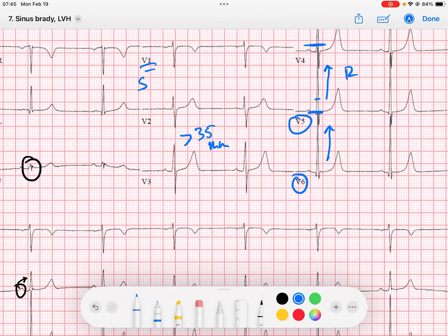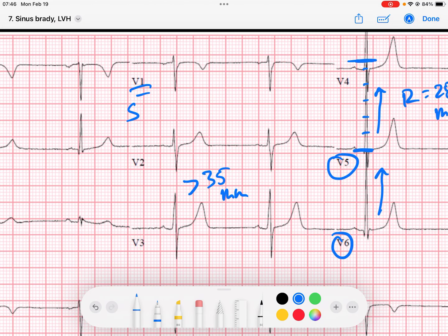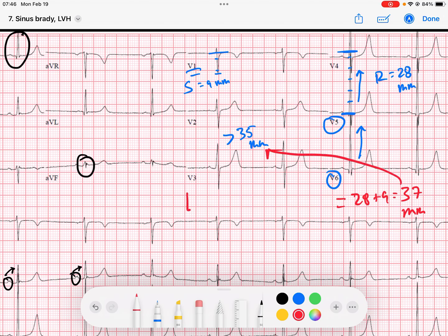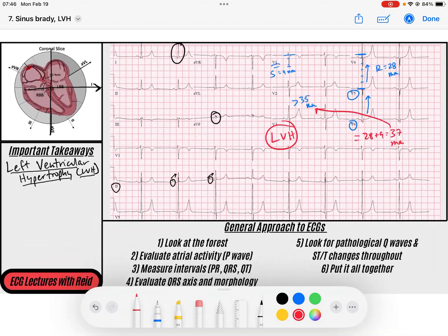Adding those together: 28 plus 9 equals 37 millimeters, which is greater than 35 millimeters. So we've got left ventricular hypertrophy by that criteria.